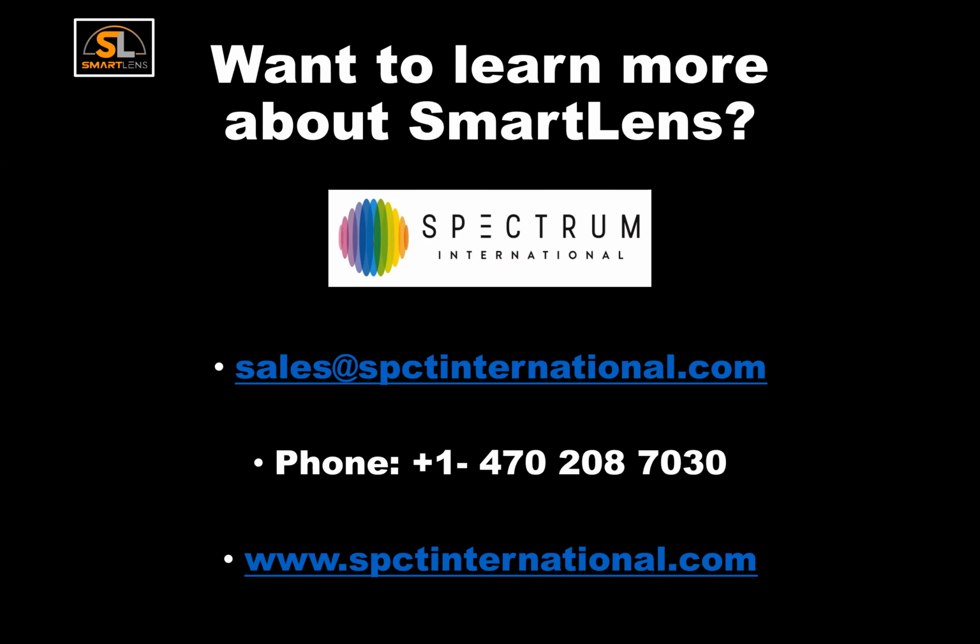If you see some signs of edema, you can reduce the sagittal depth of the SmartLens. You can control it in steps of, we talked about 25, but you can actually go in steps even lower than that if you needed to. You can make the SmartLens thinner. So there are things we can do besides reducing the apical clearance to try to increase the oxygen permeability of the lens. I think you answered that perfectly.